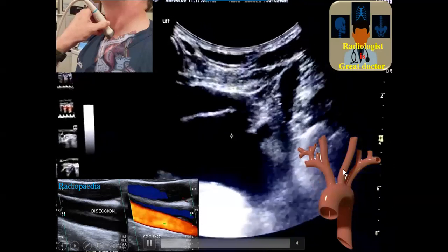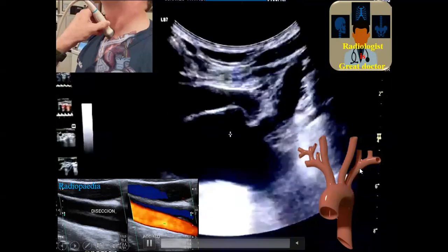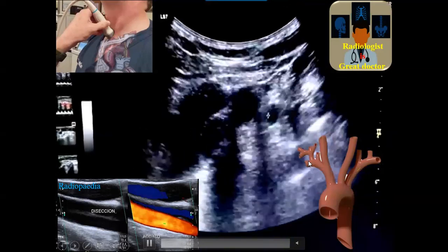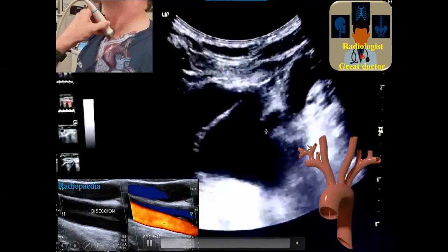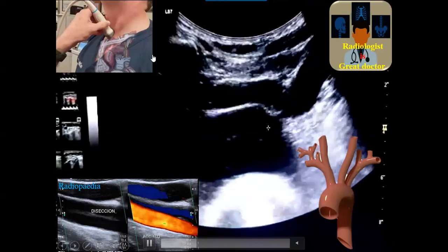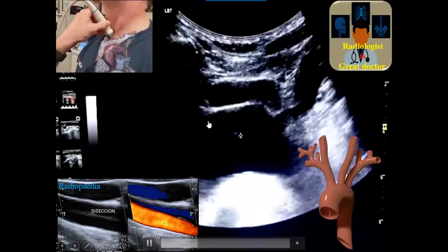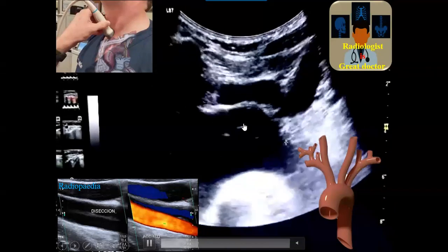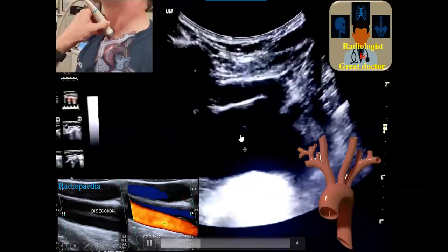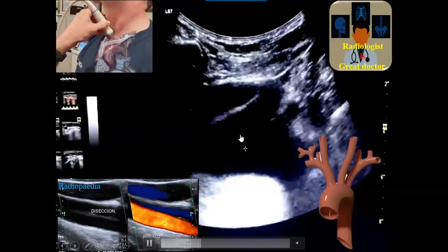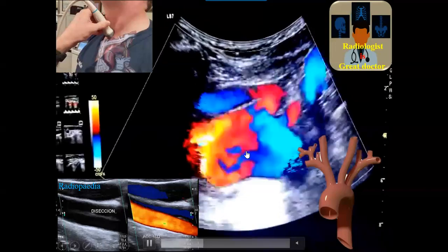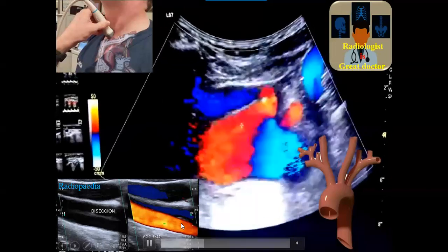The third branch is a little bit difficult because it is deeper — you need to move the transducer a little to the left. You can then confirm if there is an intimal flap in the aortic arch dissection, either by B-mode or by color mode as well.